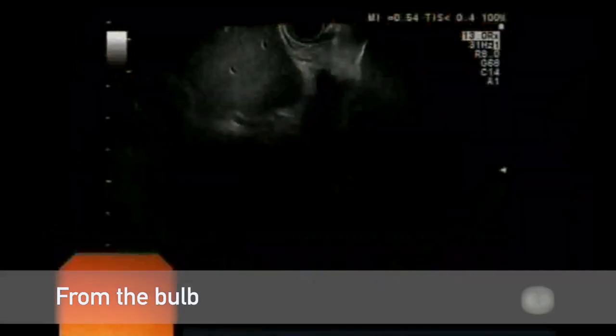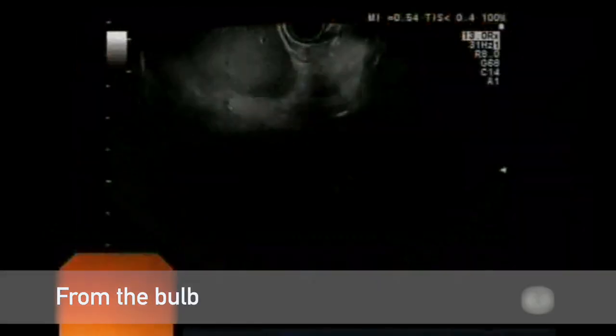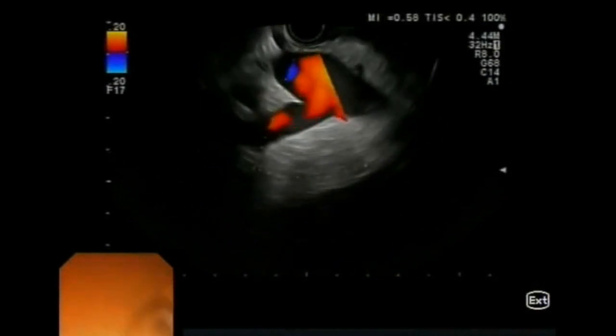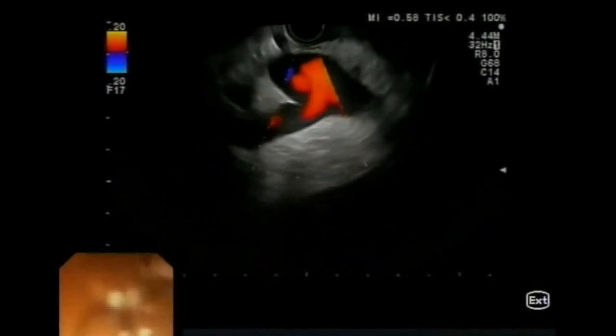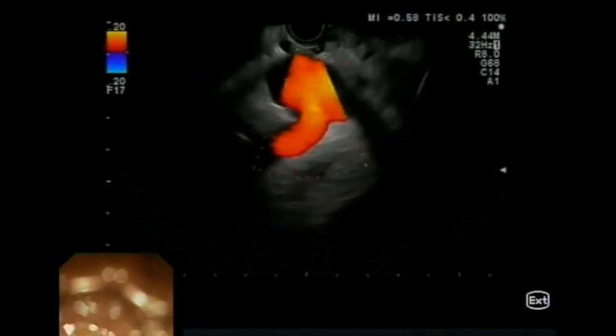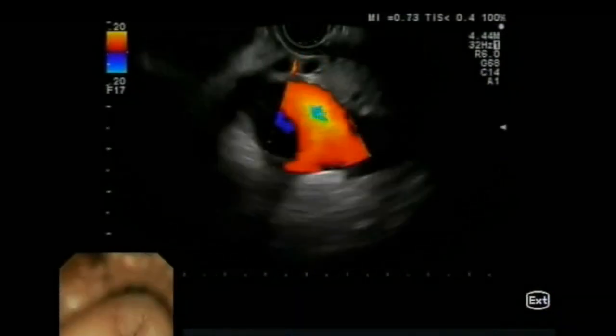To study the head of the pancreas from the bulb, we need to push the scope down into the stomach, passing through the pylorus and look endoscopically at the apex of the bulb. Here we switch to ultrasound imaging and look for the portal vein closer to the transducer. From the portal vein, we can trace the bifurcation into the splenic vein going down on the bottom left side of the screen and into the superior mesenteric vein on the bottom right side of the screen.